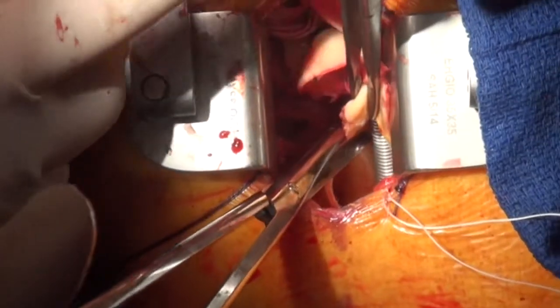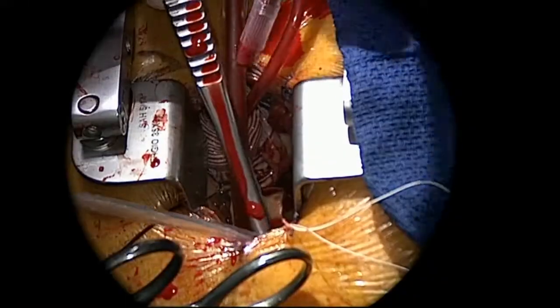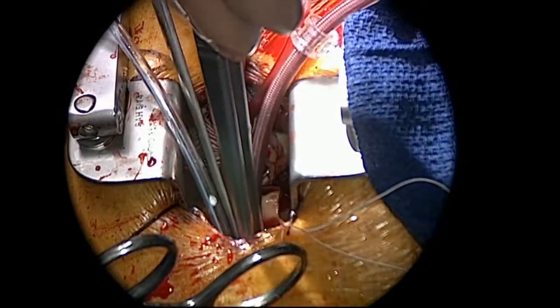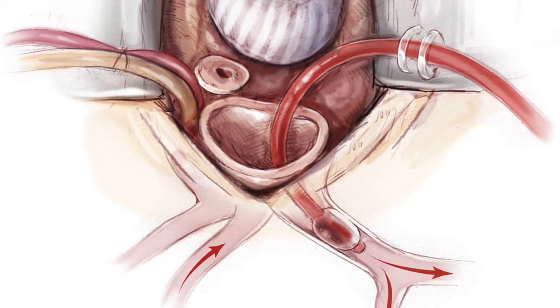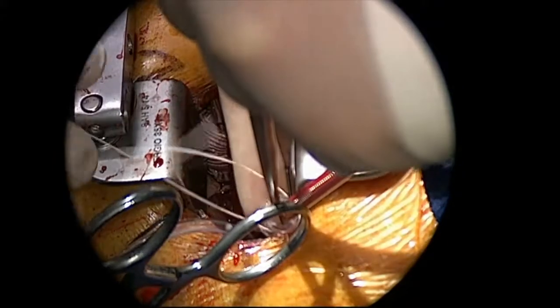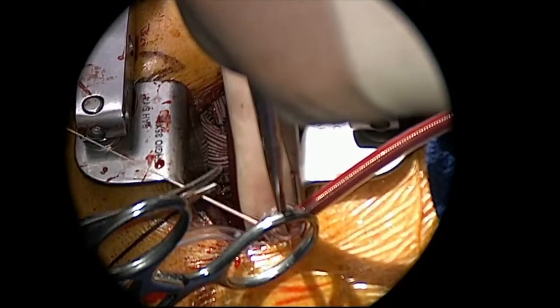You can get a view into the arch of the aorta just down there, with the sucker in it. We're now placing the antegrade cerebral perfusion catheter — we run this at 500 mils a minute. This patient is at 25 degrees centigrade. We're fixing this to the skin to keep it out of the way.